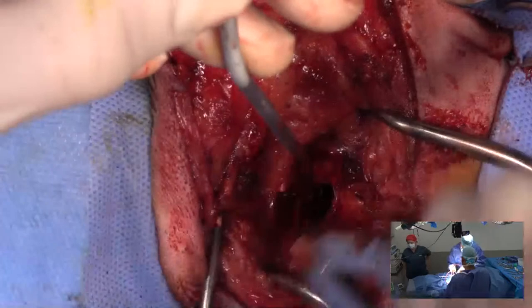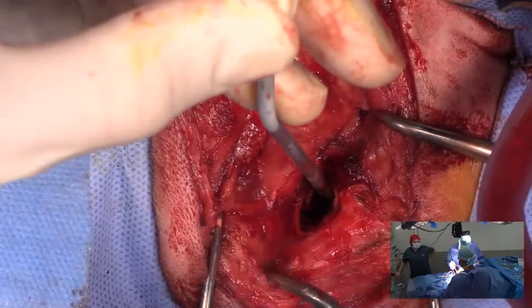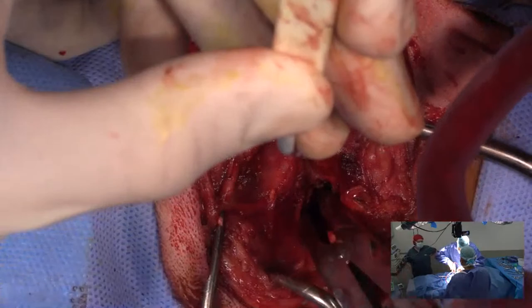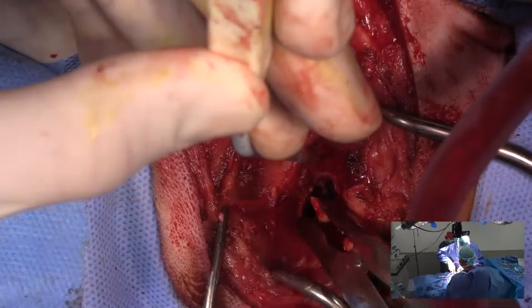Taking the whole floor out of the tympanic bulla. If you leave too much of the bulla, you're going to leave some secretory tissue in there, which means that you're going to get draining tracts formed down the road. And so I really take my time making sure I'm getting, number one, enough of the tympanic bulla out, and also that I'm getting all of the secretory material out.